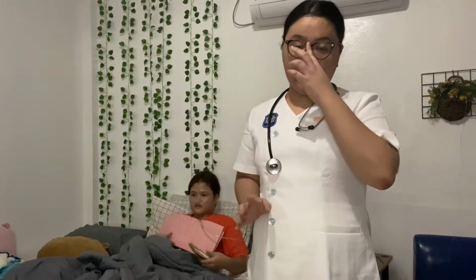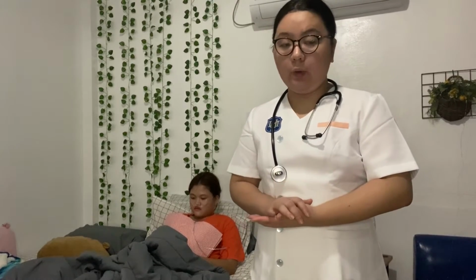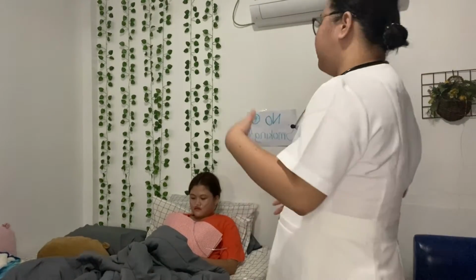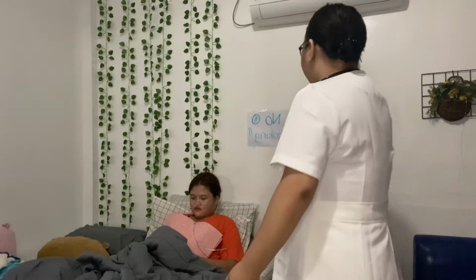So for the implementation, safe and quality nursing care, of course, I need to wash my hands and also turn the suction device on and set the vacuum regulator to appropriate negative pressure. So imagine that I already washed my hands, and then after that, I wipe my hands and I'm going to turn on the suctioning device. And then, management of resource and environment.